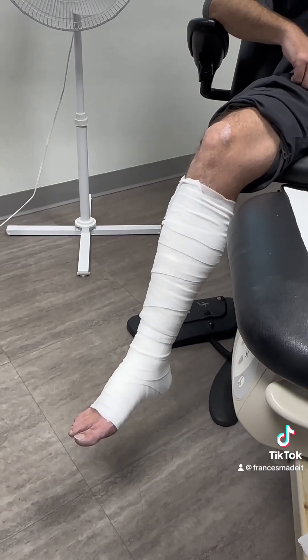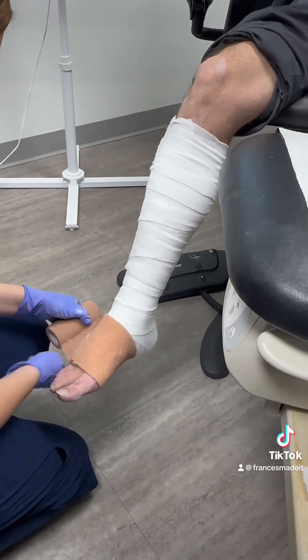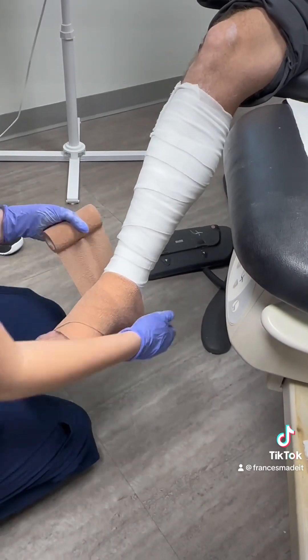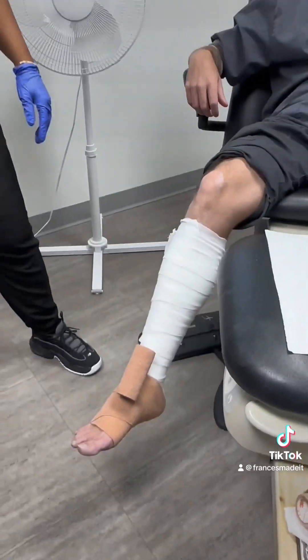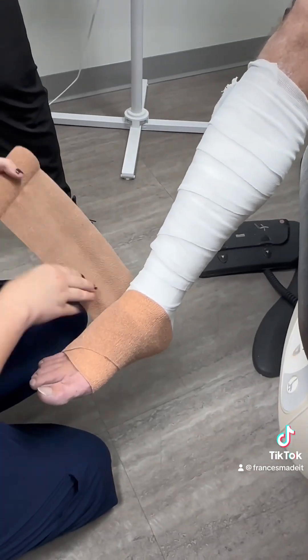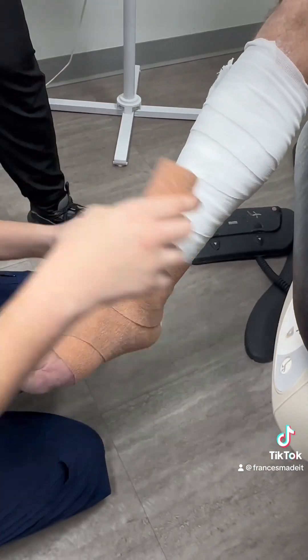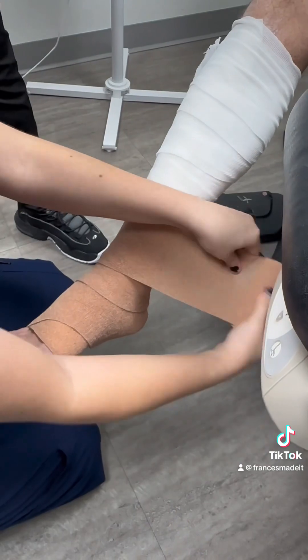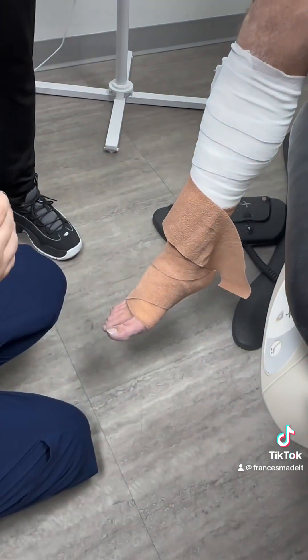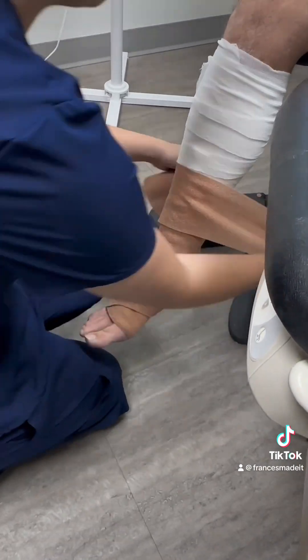Then you're going to use Coban, which is a compression bandage. Start also at the forefoot and work your way up. You don't have to stress so much about doing a figure eight because it's hard to manipulate this type of bandage. Don't try to compress it too much — pull a little, then lay it down, and continue to pull and lay it down. Your coverage should be about 50% up the extremity. This is used for swelling, which is typically why we apply an Unna boot — and that's all, folks.